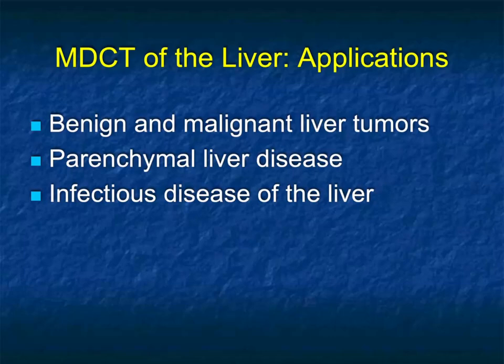Now, in this talk, if I speak about the liver in general, I could focus on applications: benign tumors, malignant tumors, parenchymal liver disease, infectious disease. Recently, within the last year, we did a talk on parenchymal liver disease. So this talk is going to focus on hepatic masses, both benign and malignant.